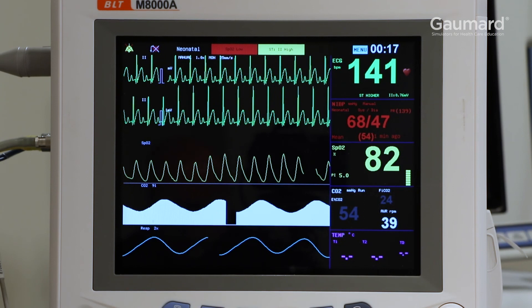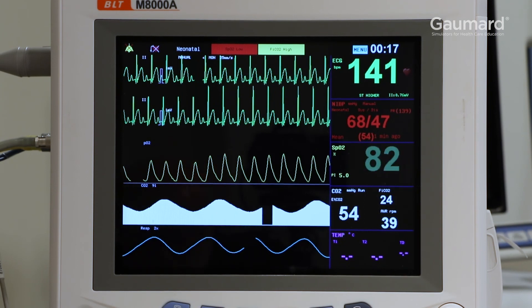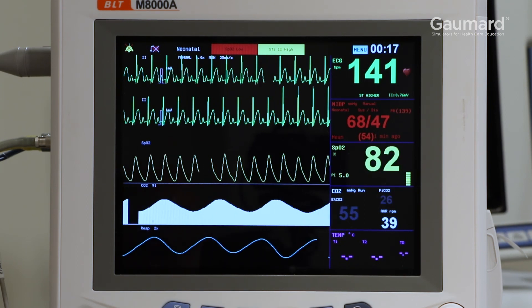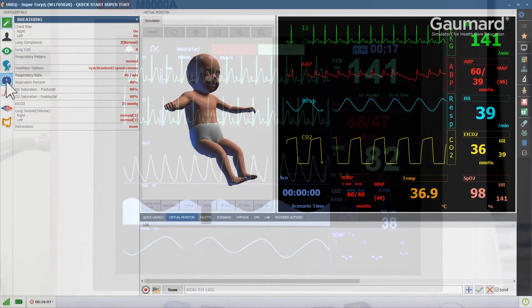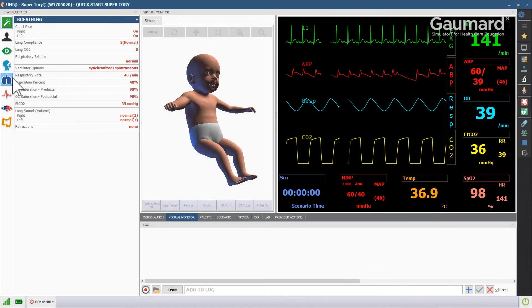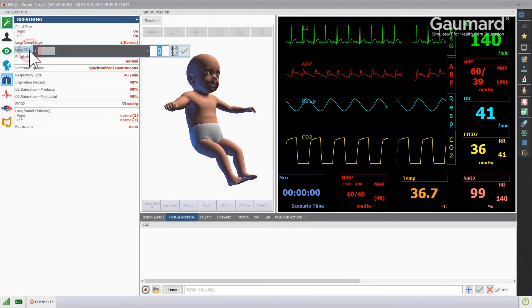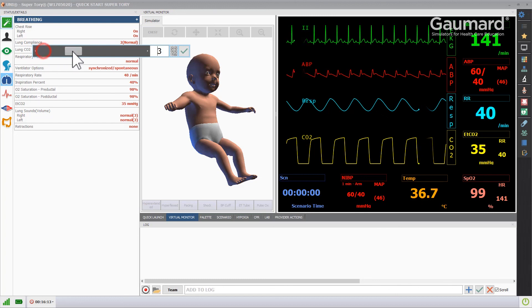SuperTori is capable of exhaling real, measurable CO2 with every breath. To control the amount of CO2 exhaled with each breath, click the lung CO2 vital and move the slider to the left or to the right.